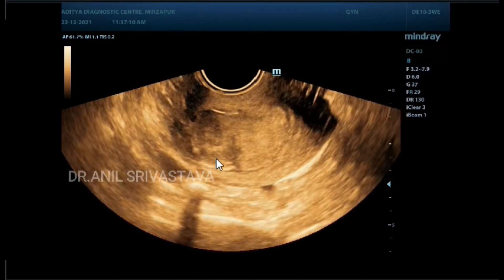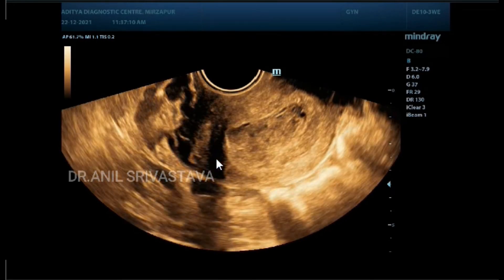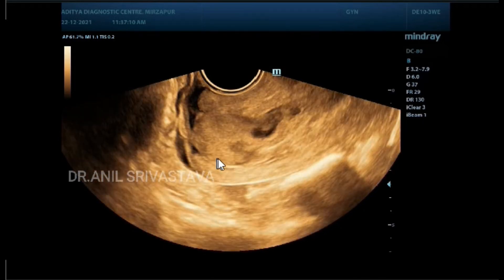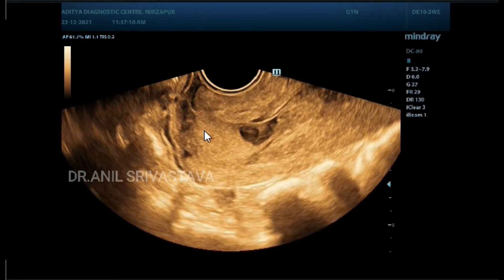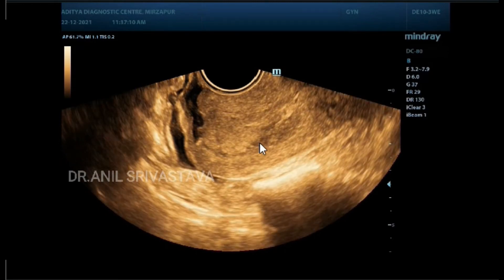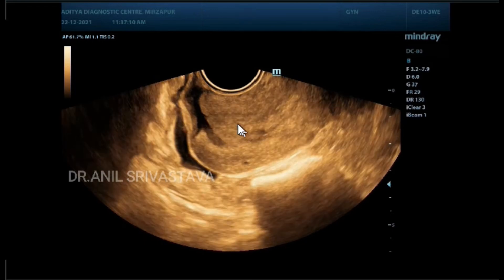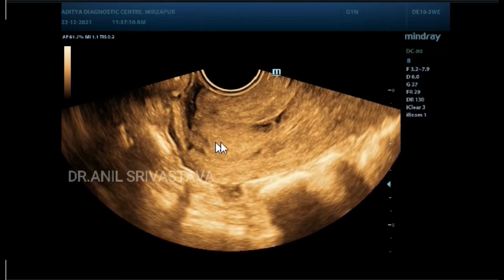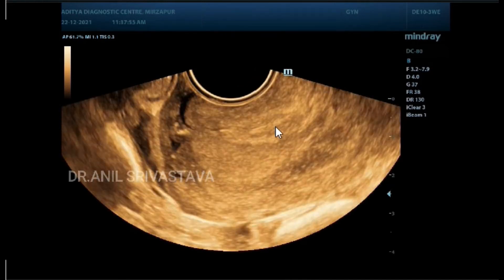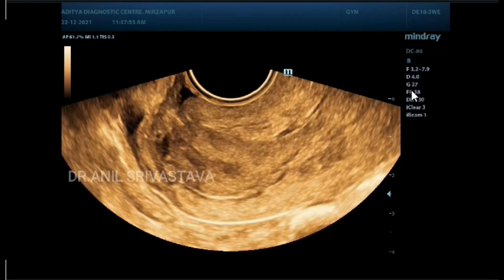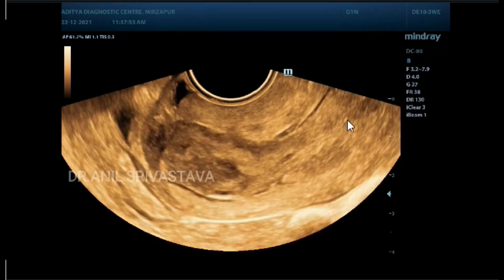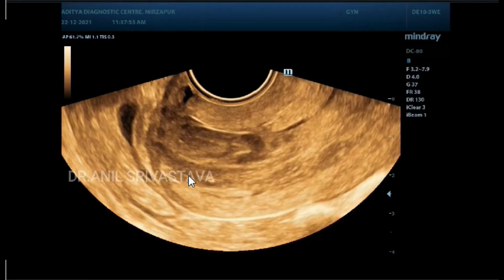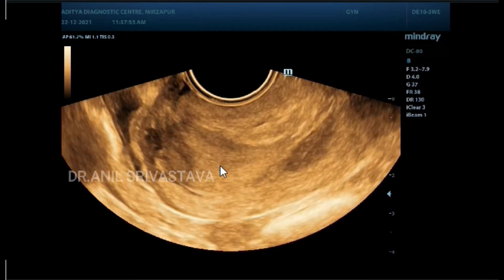This is the endocervical canal. This is the cervical lip, and this mass is coming out from the external os partly. You can see the mass coming from the endometrial cavity to the endocervical canal — this is the external os, this is the cervical lip — it is trying to come out.